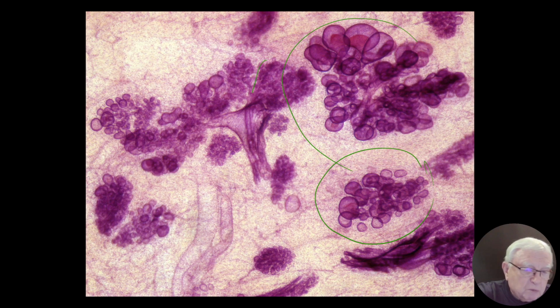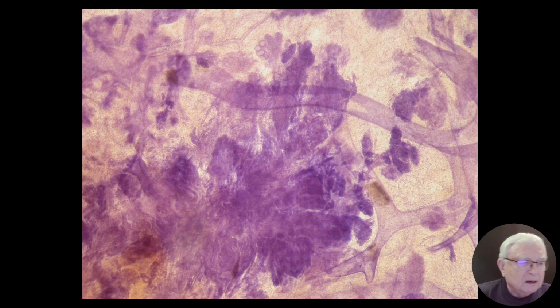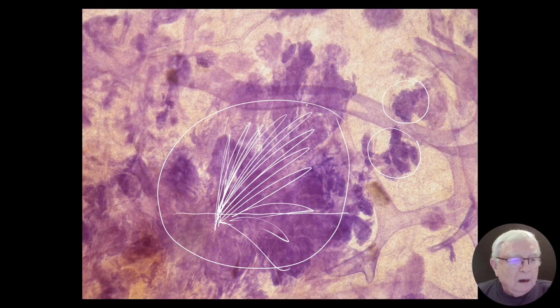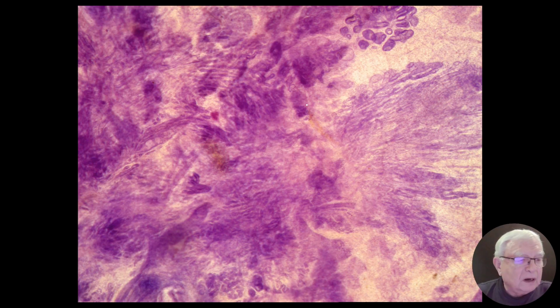Now we are at adenosis. Microcystic adenosis, blunt duct adenosis. This is really adenosis. You see the fingers like this. And here is the control group for you. This is normal. And this is adenosis. So let me show you then sclerosing adenosis. Here it is. How many acini? Many. Hyperplasia, hypertrophy. I don't care as a radiologist until there is oyster pearl-like calcification. And then the anxiety level goes up.